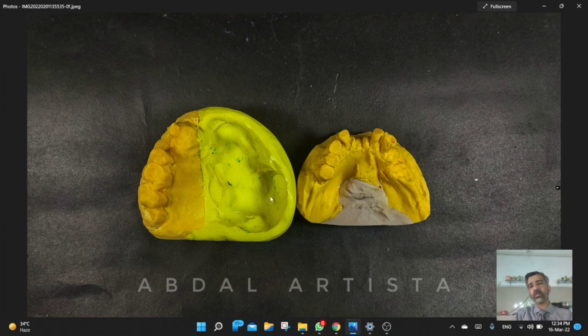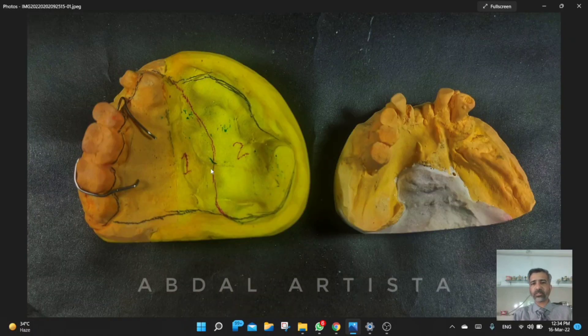This was the old model and this one was the new model of the defect area. Both parts were joined together — this is the sectional impression technique, also known as a sectional model. Using this technique we had the final impression, and after that we started the fabrication of the framework.